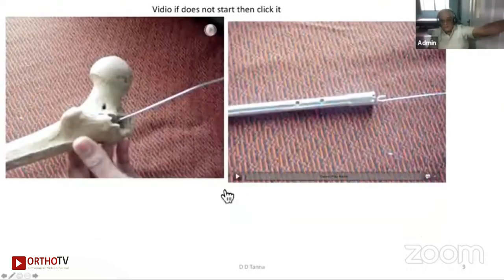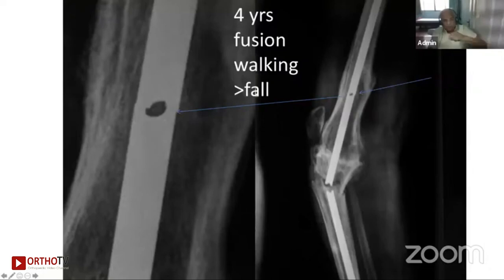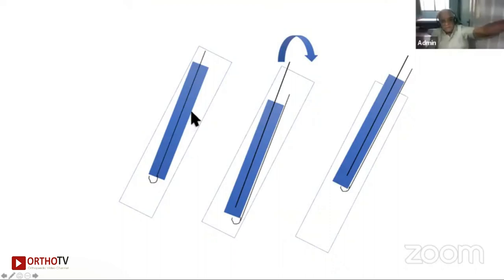You can see this is how it goes inside, and it can go inside, or it can go even outside. Here you can see it is going in, and you can take out the whole implant with this hooked wire. Or here you can see this has been broken at two ends. This is the hooked wire which has been inside one fragment. And when it went up, it was going up and up, and it got jammed on one side. So once it was inside, now I put it outside.